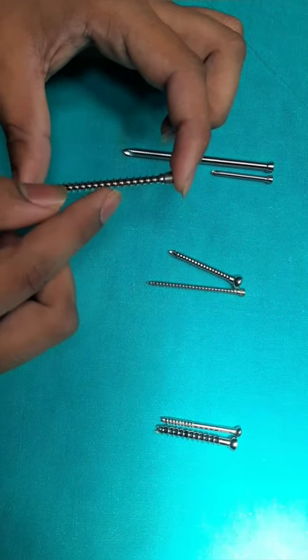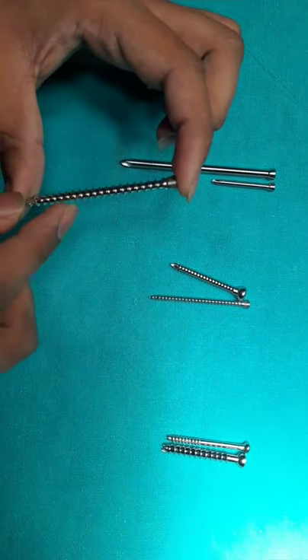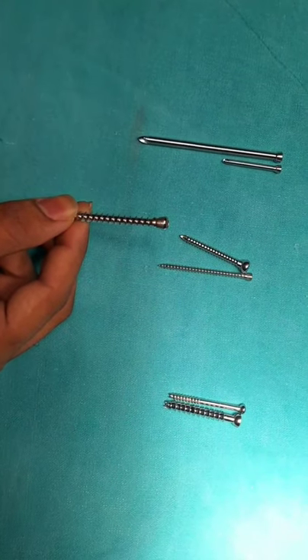The core diameter is less, the threads are larger, and the pitch is higher. This provides greater surface area for purchase and better fixation in cancellous bone.